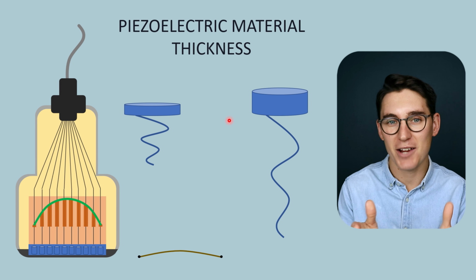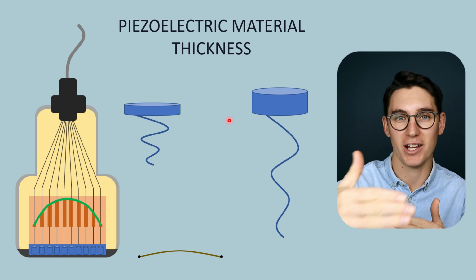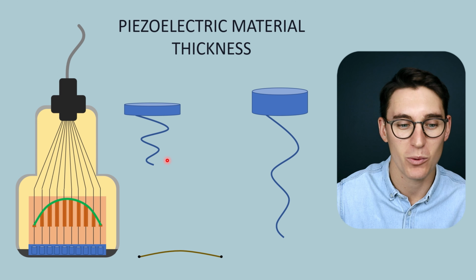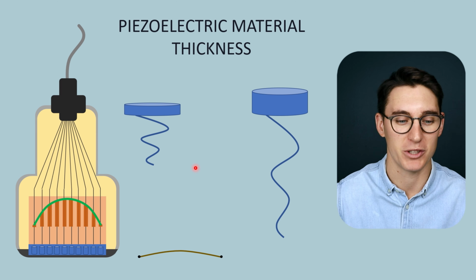And we've seen that high frequencies get attenuated quickly. They give us a shallow depth of view within the tissue. The lower frequencies travel a longer distance before being attenuated. But our higher frequency waves have shorter pulse lengths, allowing for better axial resolution. Again, we're going to look at resolution in our image.